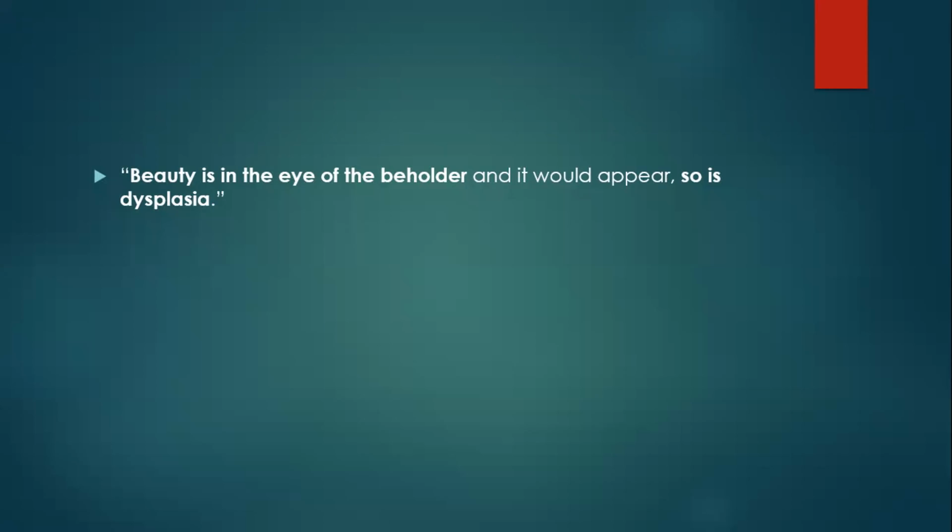a definite lesion. Then again, when you're seeing an ulcer, definitely you have to get your antennae up. Ulcer coming back, you have to think of a recurrence first and foremost. And again, if necrosis is there, that again is a challenge, because you will not see any of this. Moreover, if secretions are there, that is another challenge in post CTRT cases. Your secretions, everything will look cyan in that case.